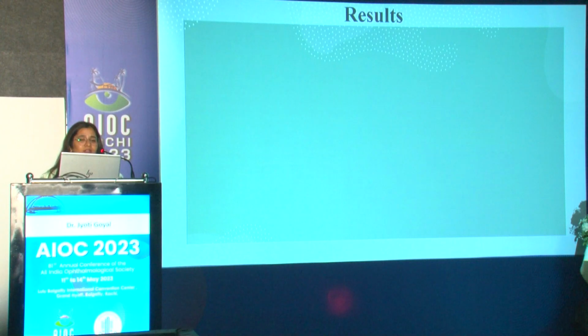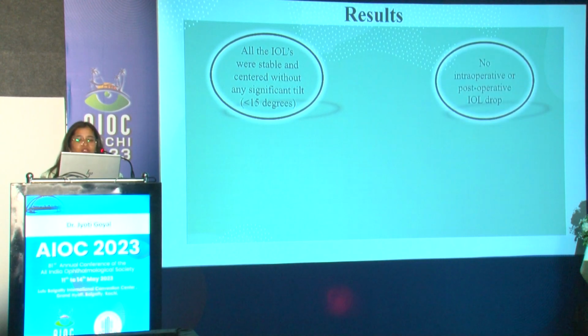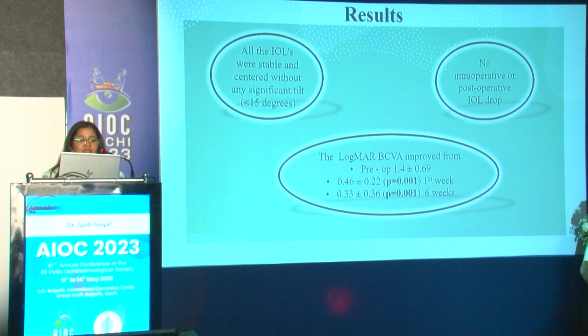On the analysis of 10 patients, these are my results. All the IOLs were stable and centered without any significant tilt. There was no intraoperative or post-operative IOL drop in these 10 patients. The logMAR visual acuity improved significantly at the 1st and 6-week follow-up.